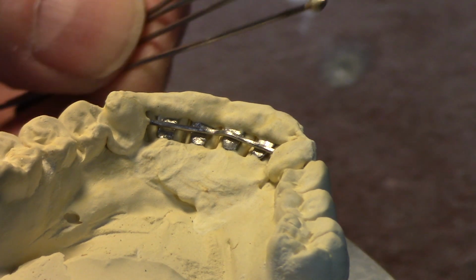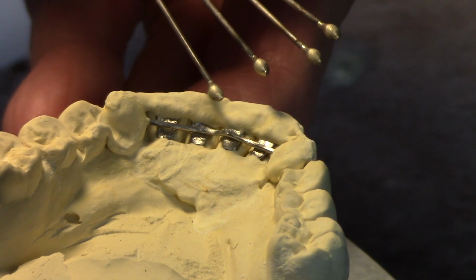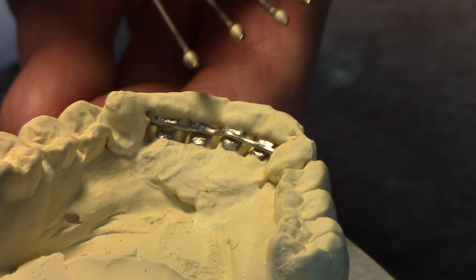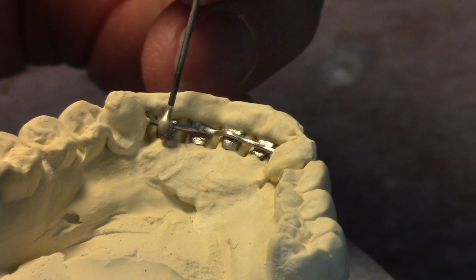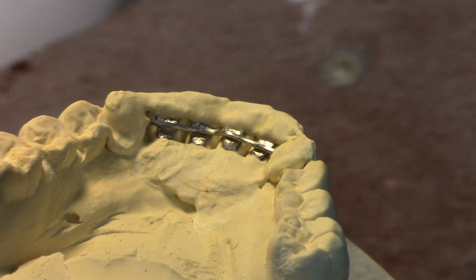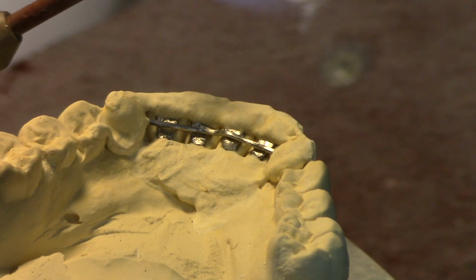And what I've done is I've shown this probe thing before in other videos, but I've got solder already preloaded onto 4 wires. And this is the nickel silver alloy solder I use in all my videos. There's a lot of discussion about that if you want to know more about that on my other videos. But I'm going to just simply dip this in flux and transfer the flux onto the solder area and let the solder transfer over to the pad. Real simple procedure. Now I've got my propane oxygen torch, and I've got the flame real small and a little bit hot.